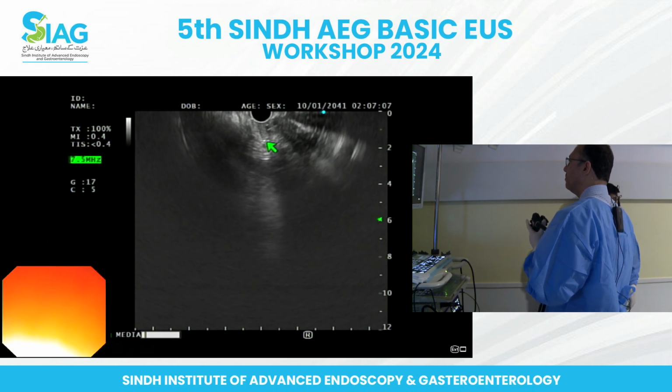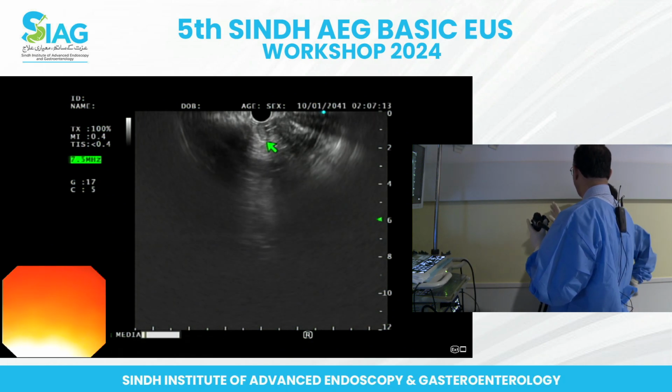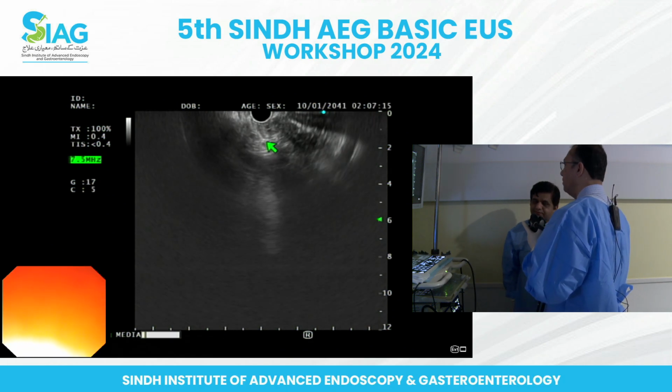Can I have my needle, please? So millimeters. Okay, sir.